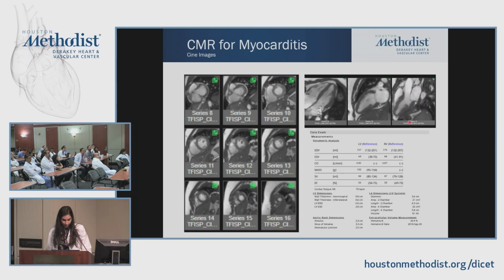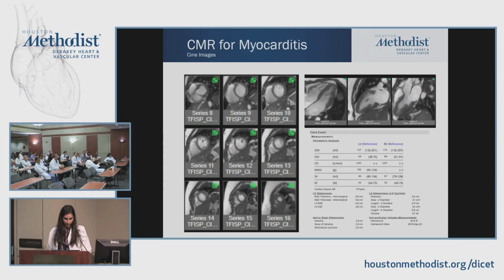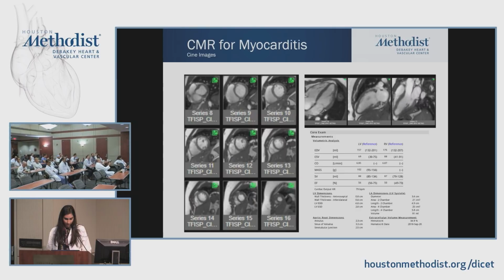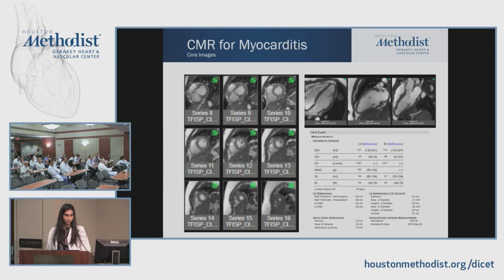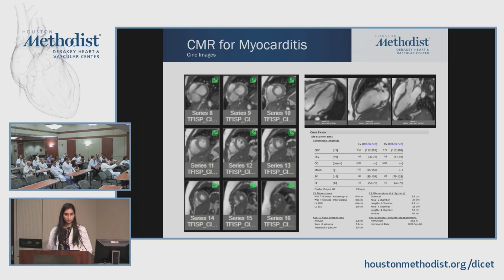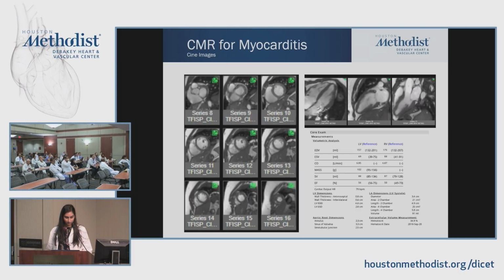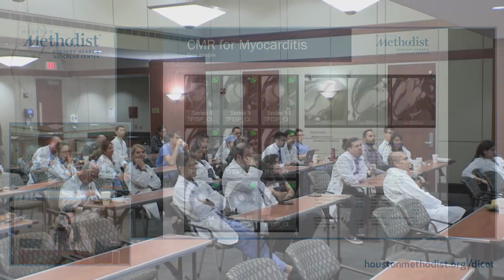Yes, that's the one. And again, you're not letting yourself get fooled by looking at wall motion. Rather, you're focusing on wall thickening, right? That's the key thing, because sometimes you can have translational motion. So I agree with you. That area, that's an area where I'd want to make sure I look carefully at the delayed enhancement in that location, because that's a subtle area where it does look like there may be a regional impairment in wall thickening.